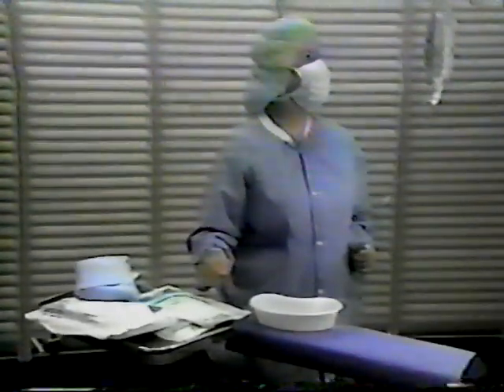Sterility can be compromised if permeable materials are used. When moisture soaks through a package, it's called strike-through. Any article that has become wet is considered contaminated, even if strike-through cannot be directly observed.